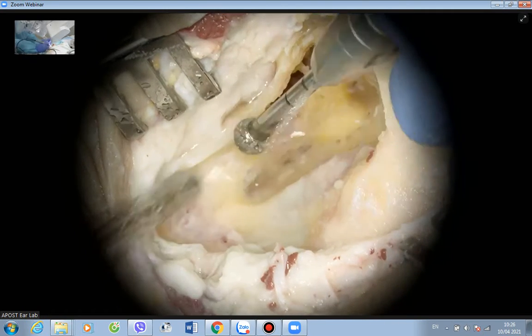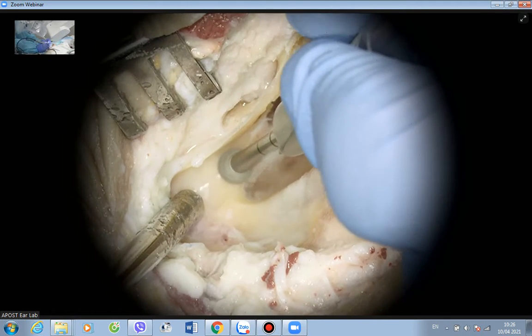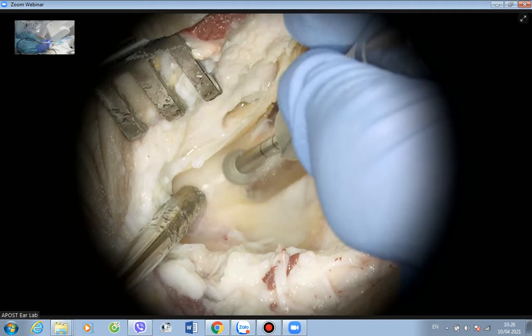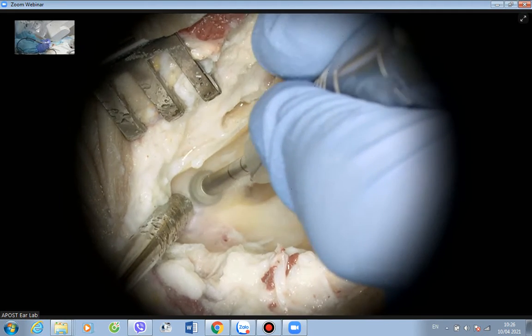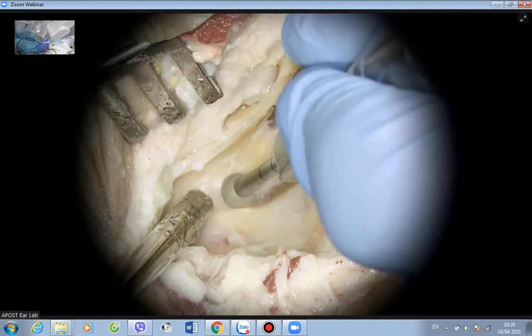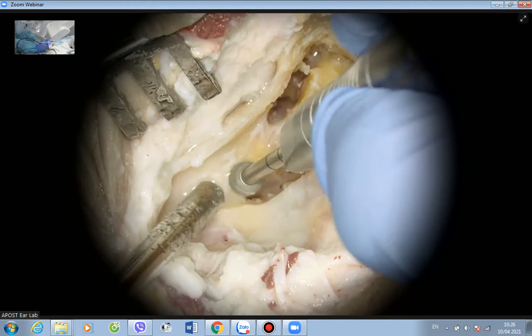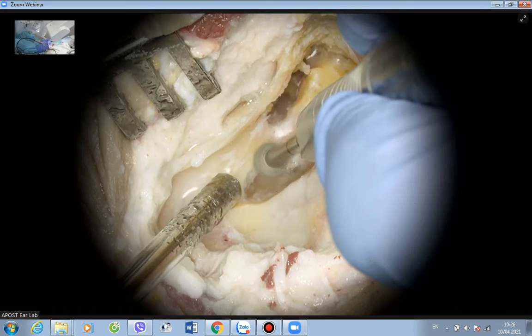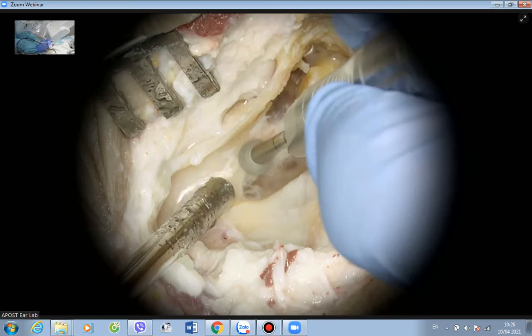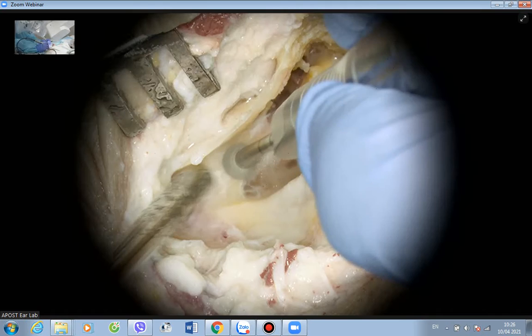So I'm now using a diamond burr. So you have to familiarize yourself with your burrs. You will choose the biggest possible burr that is working good for you. If you need to do a lot of cutting action, then you use a cutting burr and you cut it by the side. If you are working like me near very important structures that you don't want to cut, like your facial nerve, and you have to do it end on, then we use the diamond burr. With the diamond burr, it creates a lot of heat.